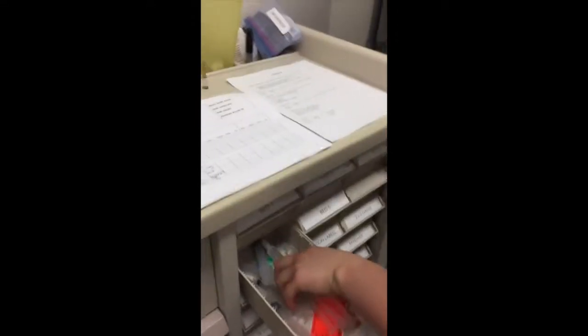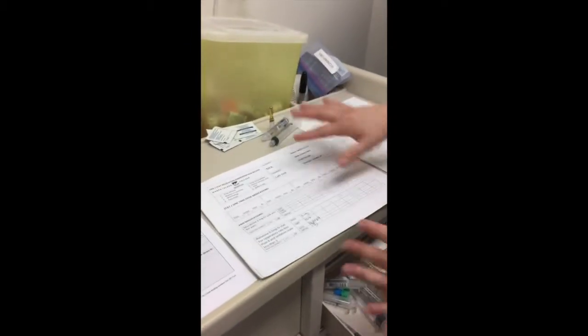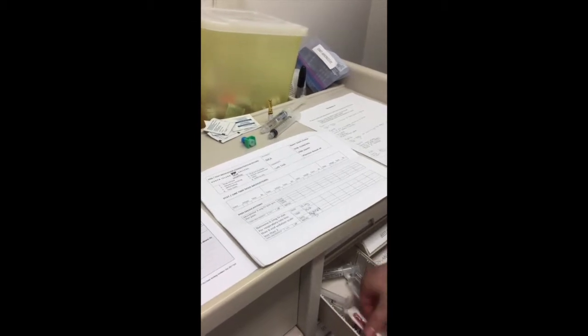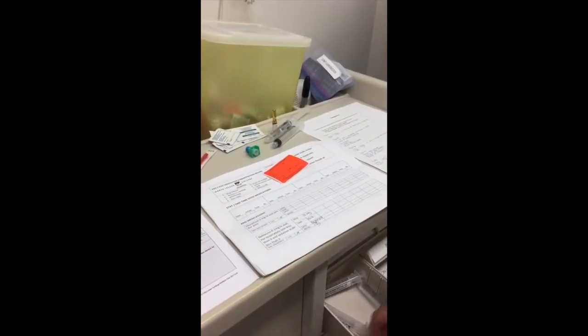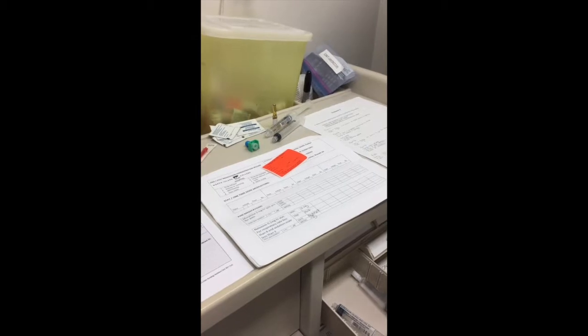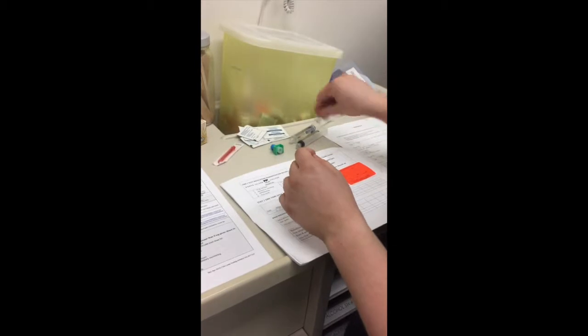I need something to dilute with, something to mix with, and this would all be in sterile packaging. I've got my little mixer doohickey. I need to get a med label out, and I've got my blunt syringe. I also need a couple of flushes to bring to the bedside to make sure everything is flushed appropriately and to check the patency of the IV. Okay, first things first, hand hygiene.